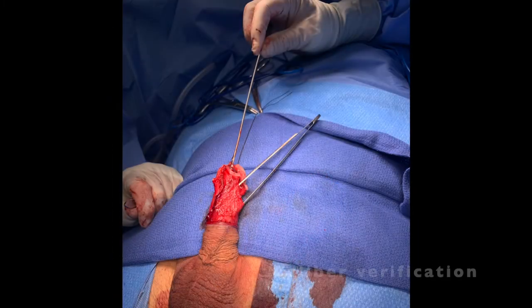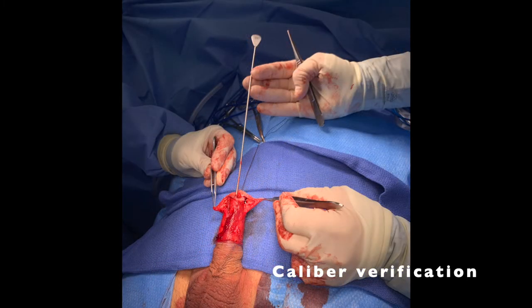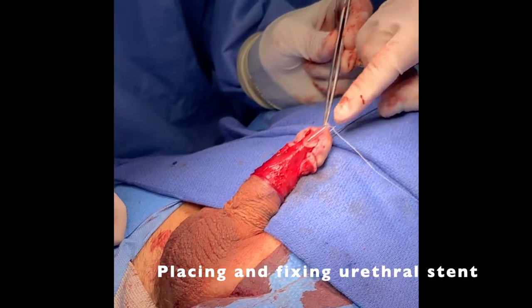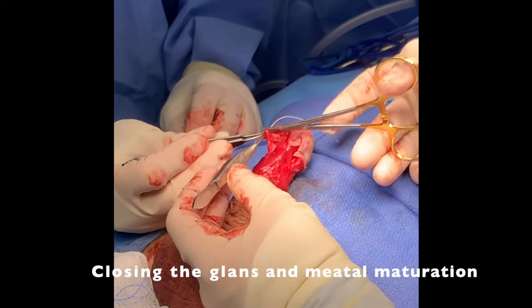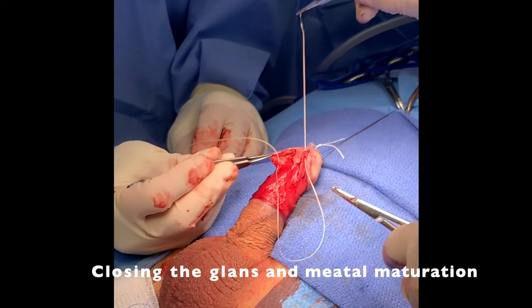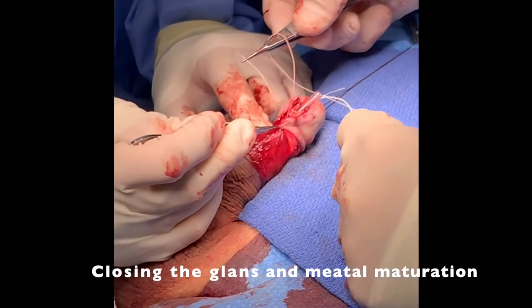The final meatal opening was able to accommodate a 30 French bougie. A 12 French urethral stent was then placed and secured to the glans. The glans was then re-approximated and the meatus was matured using a 4-0 vicryl subcuticular suture followed by a 5-0 interrupted vicryl suture down to the subcoronal area.